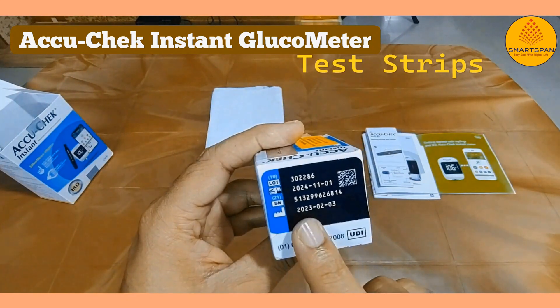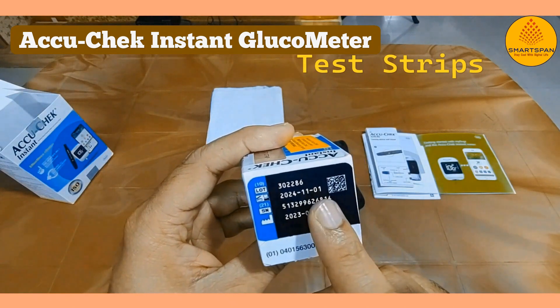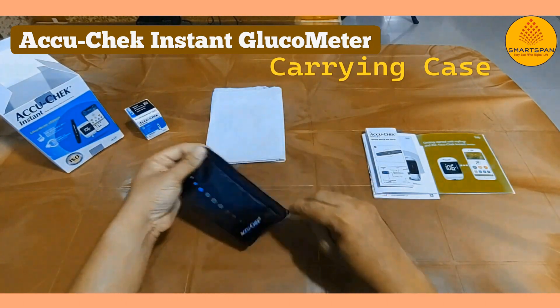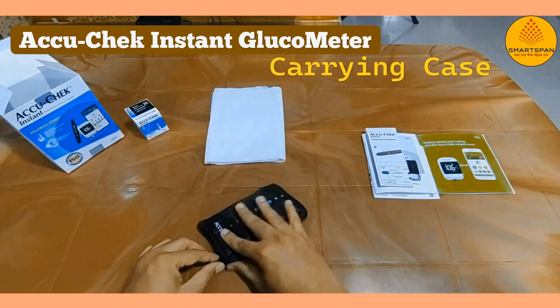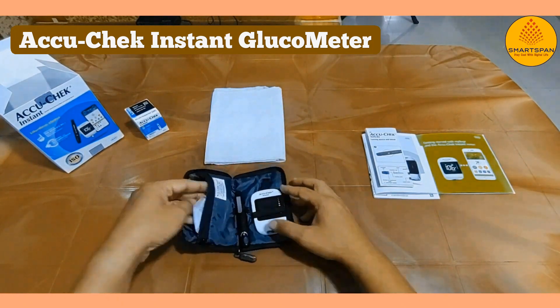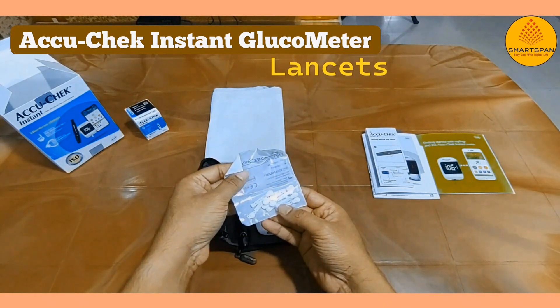Test strips — no glucometer is complete without them. These strips are where the magic happens; they help measure your blood glucose levels accurately. Always check the expiry date on the strip packet. There's also a compact carrying case included to keep everything organized and easily portable, a thoughtful addition for those on the go. Lancets ensure a gentle and precise finger prick.